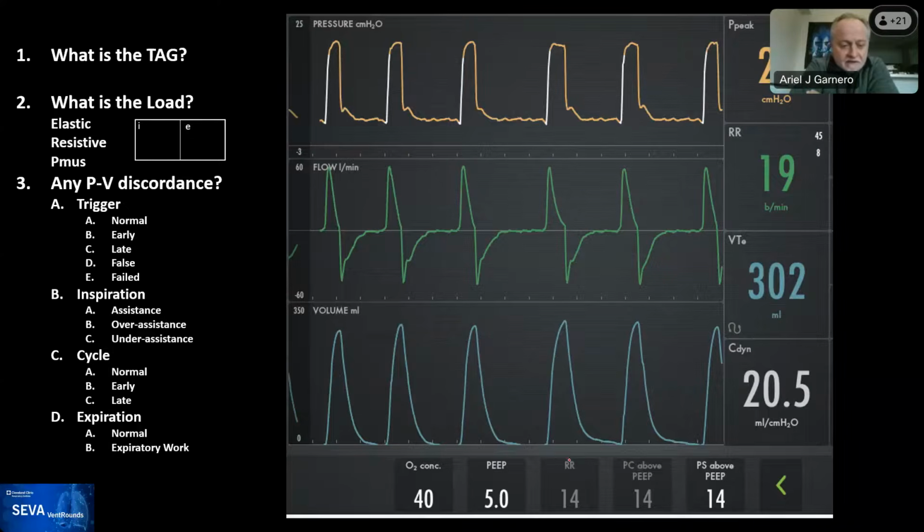Normally in pressure support, we set it at 20 seconds, so if no inspiratory effort happens in 20 seconds, a mandatory breath is reintroduced with what we call the backup apnea alarm. Auto mode introduces the backup apnea alarm into the maximum apnea time. So if no spontaneous breath happens in less than the maximum apnea time, a mandatory breath is reintroduced.